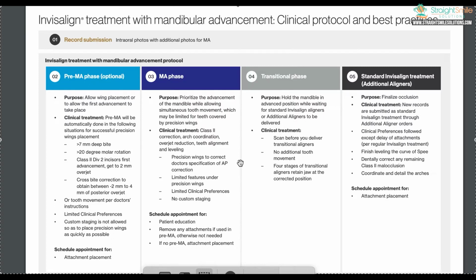So remember, girls, if they're done growing at 8 or 9, they may only have 7 teeth in. This is not going to work. It's not going to do anything. All it's going to do is nothing. So if your patient is done growing, this is designed for growing kids, and it's your job to make sure that they're growing. I can't say this enough. And don't just assume that they're 9, that they're still growing, because they may not be. Boys probably will be, girls may not be.